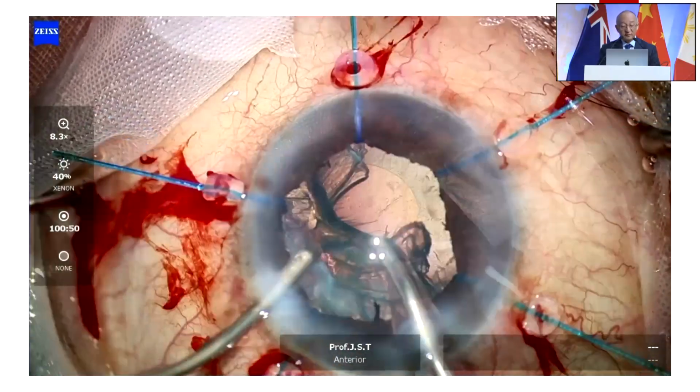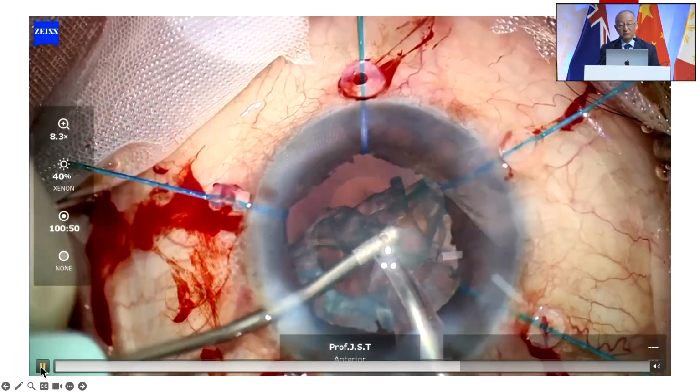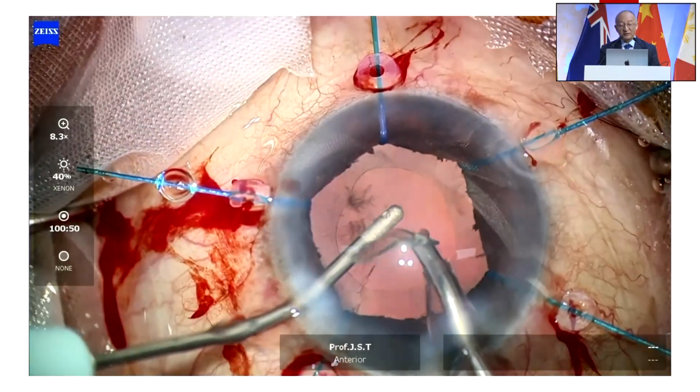And this is a technique described by our colleague Dr. Tushar. This is called a hybrid technique. So the phaco handpiece is inside only. Without compromising the chamber dynamics, we just detach the aspiration tubing and attach it to the aspiration cannula of the bimanual. In that way, you can aspirate all around now. So I'm aspirating. This is called a hybrid technique.